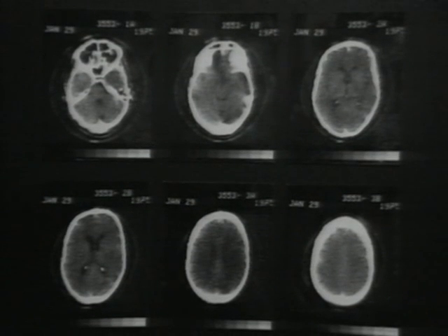Now let us consider the results and their interpretation. The pictorial display is examined in much the same way as a conventional radiograph. Structures are identified and their shape, size and position defined. Changes in absorption are then looked for.